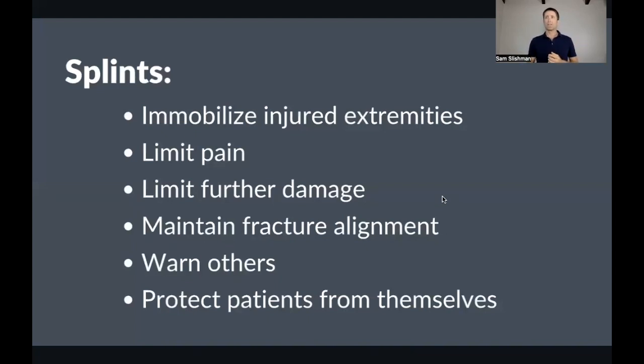And there's not a rigid definition of what is a splint, I think. If you think about a tourniquet, if you don't stop arterial flow, you don't get to call yourself a tourniquet. But with a splint, I can use a rolled up newspaper to create a splint. So I don't think there's a real difference between splint versus device, the words.